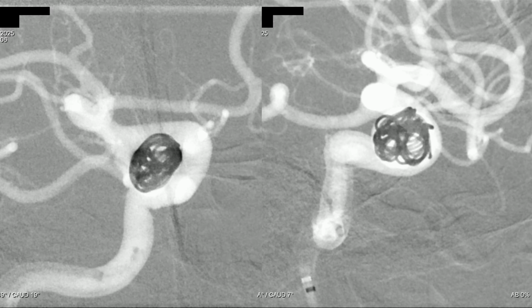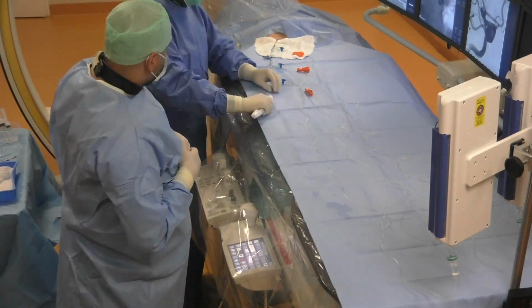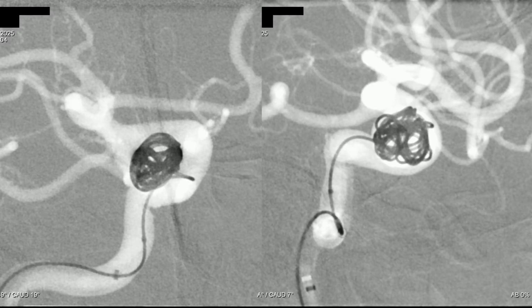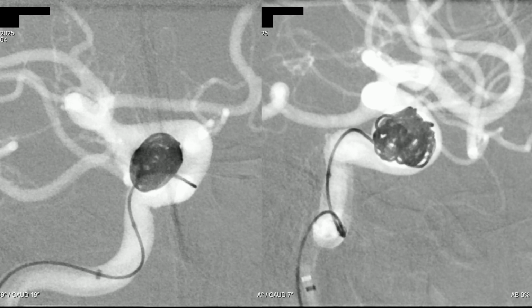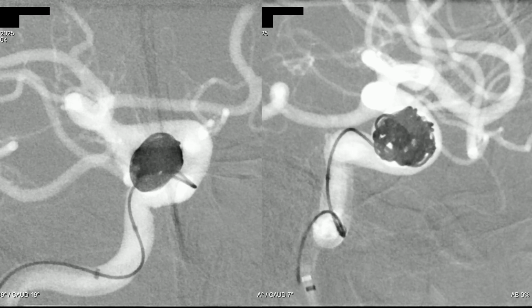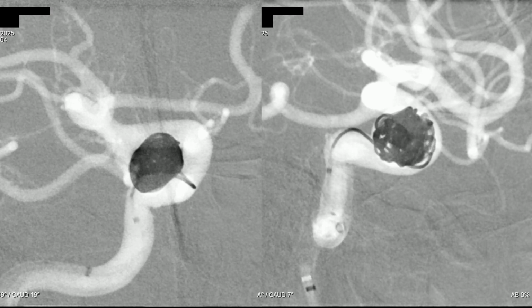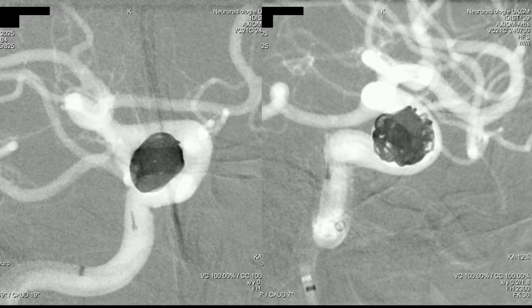And now we can detach the coil. It's a mechanical detachment device, and we take our second coil. It's complex, soft, 10 millimeters by 30 centimeters. And we continue coiling, and the basket holds this soft coil very well. And now we can detach this coil, and we are satisfied with the results of the coiling.